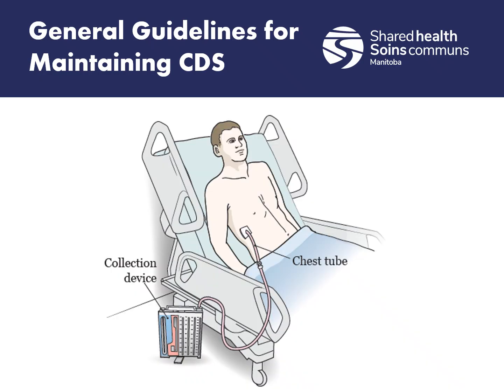Supporting these patients, we want to make sure that they're sitting upright, so this will help facilitate gravity drainage of pleural fluid and help with optimal lung expansion. And this position also can help splint the insertion site, so if they start coughing or anything, this can help minimize the pain if they do begin coughing.